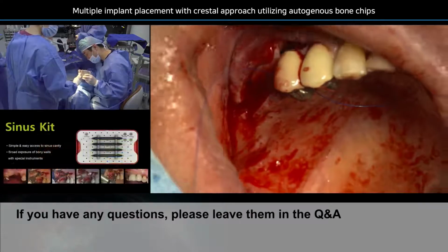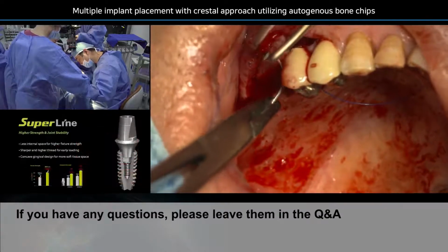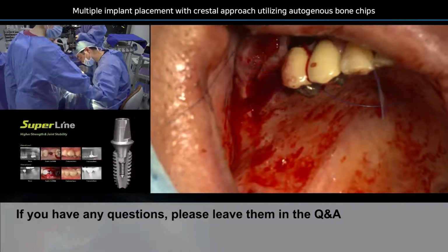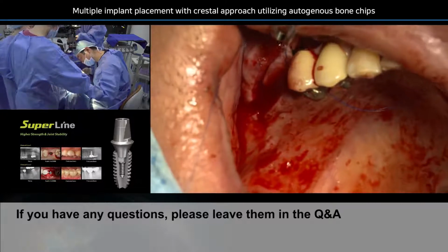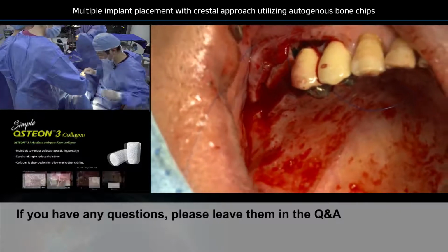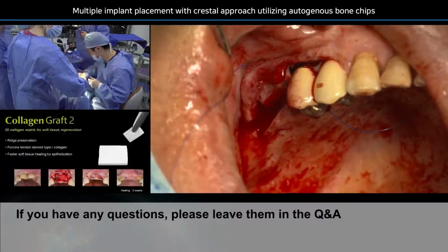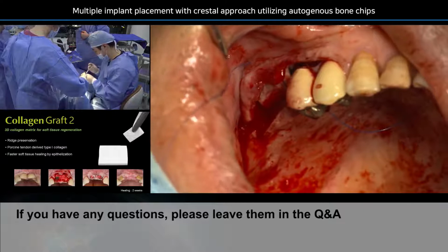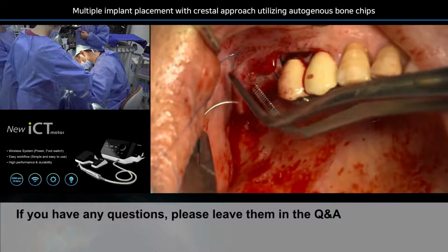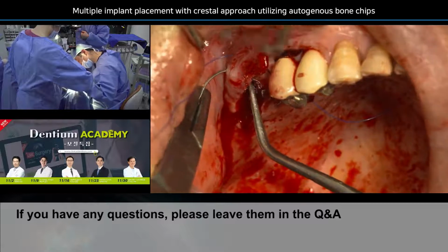You have entered from the palatal aspect very far, and now we are coming out on the buccal aspect a little bit also far. And it becomes a little bit of an interrupted suture, but stop there and do the reverse movement. If you do the reverse movement, what you will have is parallel sutures running over the membrane. So this is what we do again. You don't need to suction.